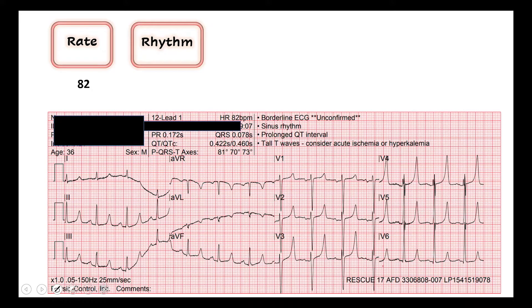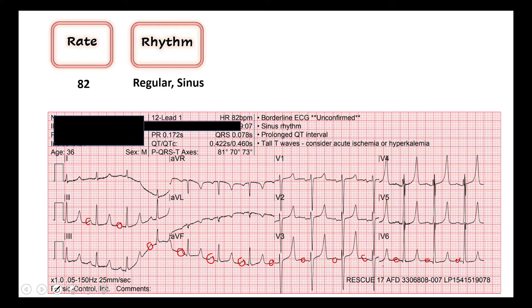Our second thing we look at is the rhythm. The two questions we ask: is there a P wave before every QRS, meaning the signal for the heart to beat is coming from above the ventricles and the sinoatrial node? Sometimes our best place to see a P wave is lead two. Working through a little bit of this artifact, I do see P waves all across the 12-lead, so we will call this sinus rhythm. Next question: is it regular or irregular? The global look at this 12-lead — it looks regular. So I would call this a regular sinus rhythm.